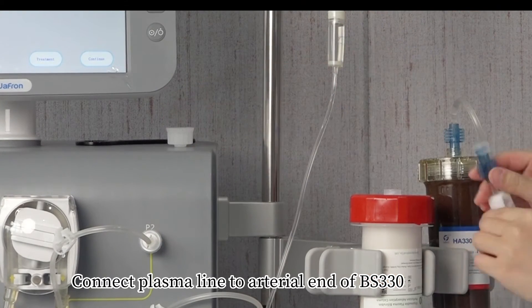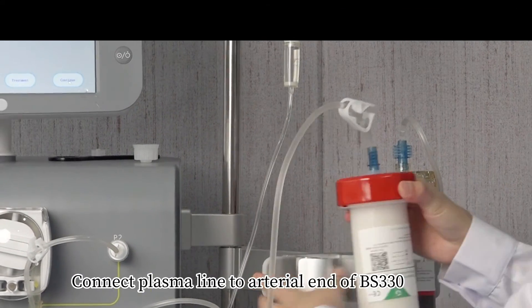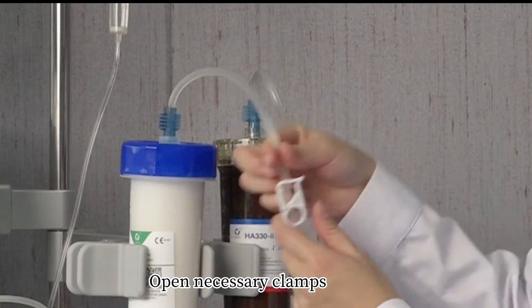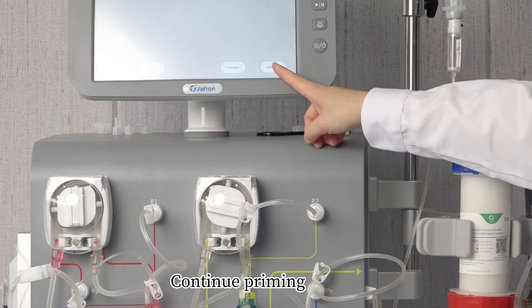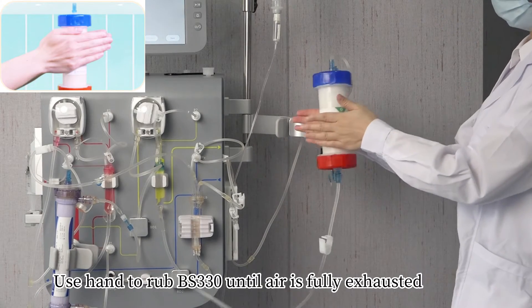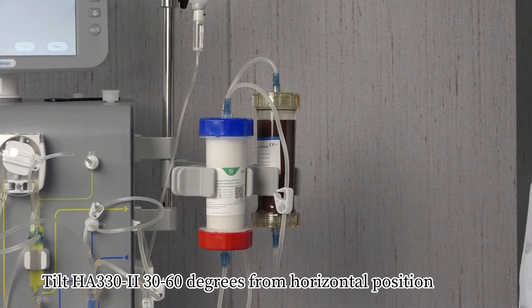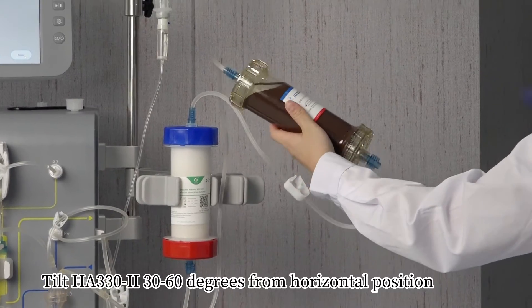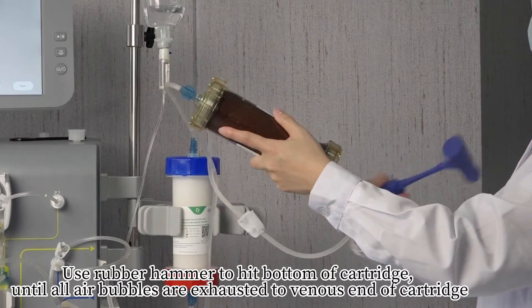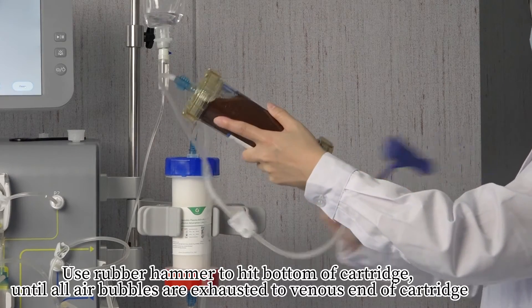Connect the plasma line to the arterial end of BS-330. Open the necessary clamps and continue priming. Use your hand to rub BS-330 until air is fully exhausted. Tilt the HA-330 cartridge to 30 to 60 degrees from horizontal position. Use a rubber hammer to hit the bottom of the cartridge until all air bubbles are exhausted to the venous end of the cartridge.